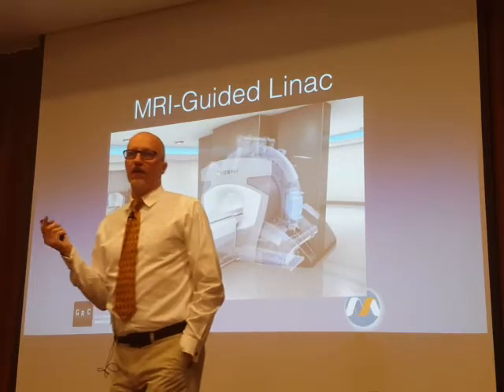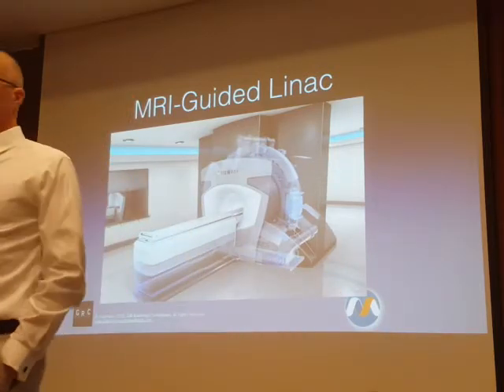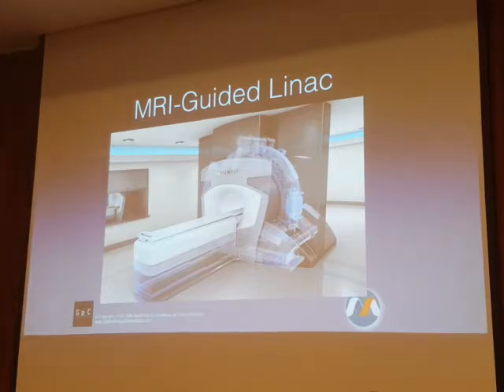These are really interesting because beam therapy, linear accelerators, primarily for oncology treatment, have typically been limited to the extremities. We haven't really been able to do beam therapy in the thorax, in the abdomen, because simple respiration moves everything around in the abdomen. So we may know where a tumor is at one moment in time, but if somebody takes a deep breath, it may move 2 centimeters. And so if we're shooting a beam, we may be missing the tumor entirely.